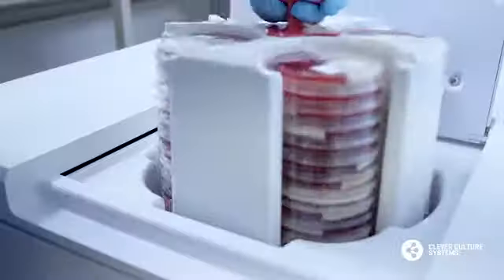The APAS independence uses machine learning algorithms to interpret images of plates. The key measurements that APAS takes are really around the enumeration of the amount of growth on the plate and the different types of colony that are detected on the plate.